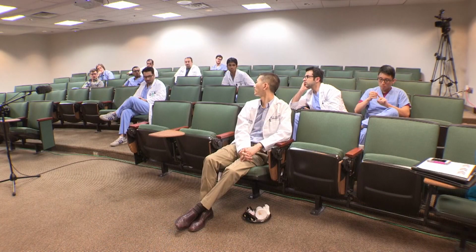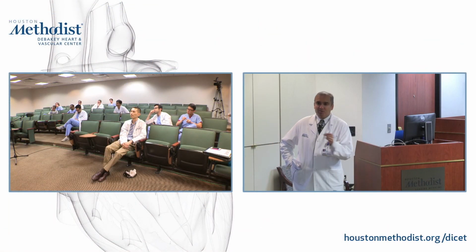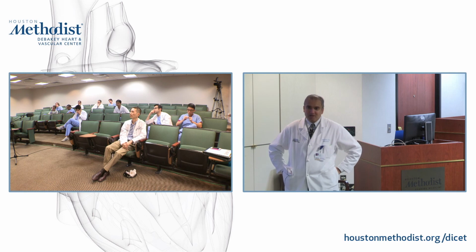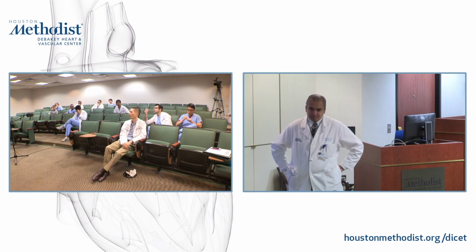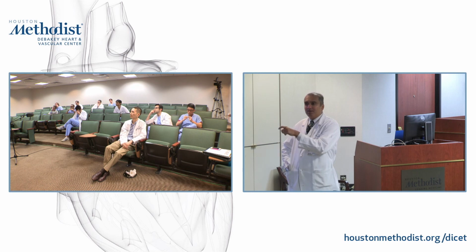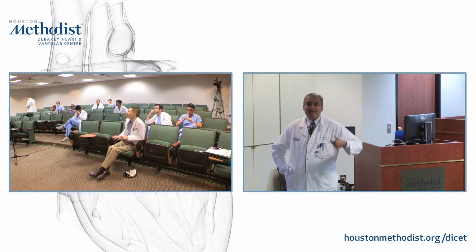How can you calculate the spatial resolution? The spatial resolution of the image that you generate? Well, that's based on the number of pixels that you generate. You're talking about the spatial resolution of the image, right? Yeah, but how does that relate to the k-space then? Oh, yeah. So the more lines of k-space you acquire, the more details or the more resolution of an image you're going to be able to achieve. Right? So the greater the number of lines of k-space.